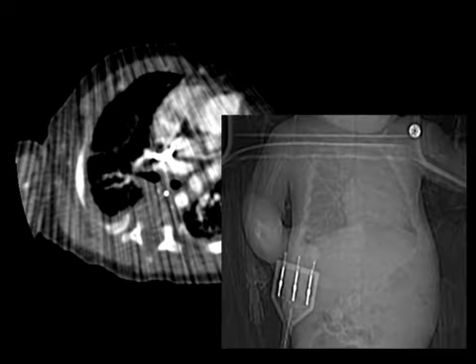So here's a CTA that would have normally been quite good, and it was a fairly low-dose examination, but when we set up the patient, we neglected to get rid of these cardiac leads here on the side of the patient. Significant streak artifact. We were still able to see what we needed to see, but there would be some indications where we would have had to scan this child again.